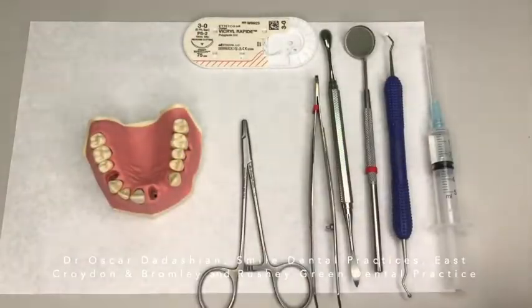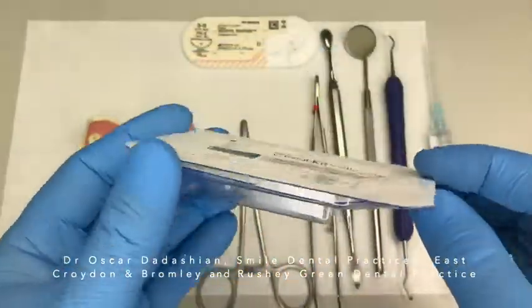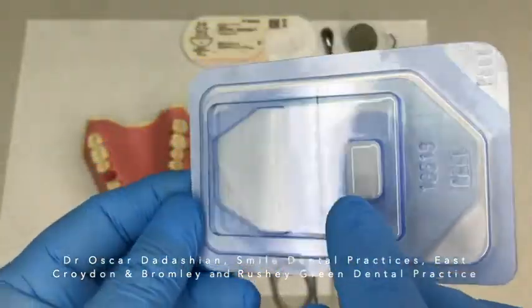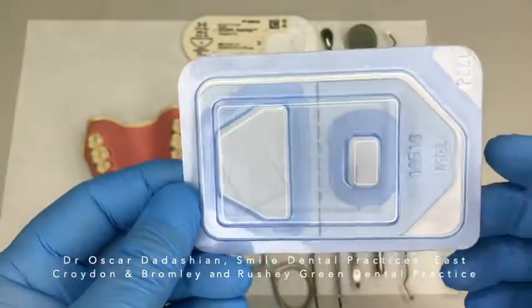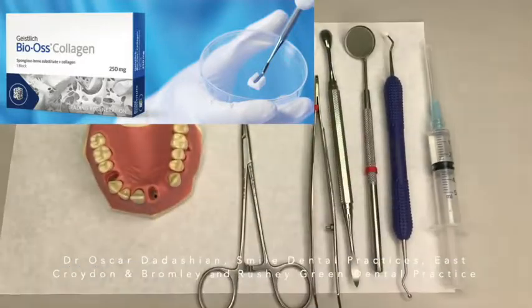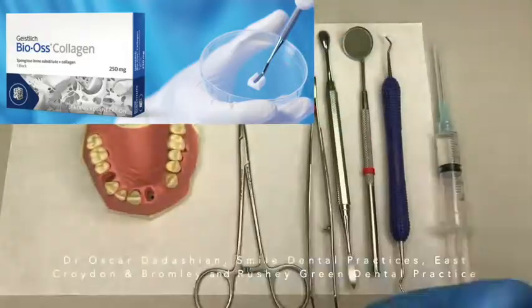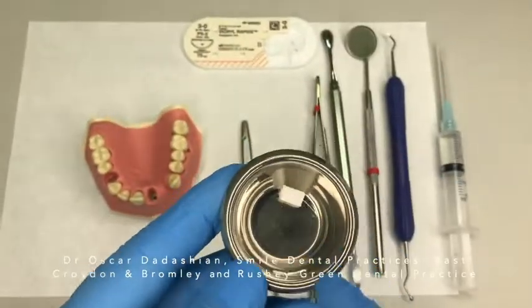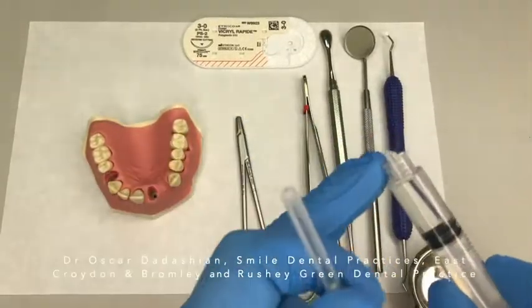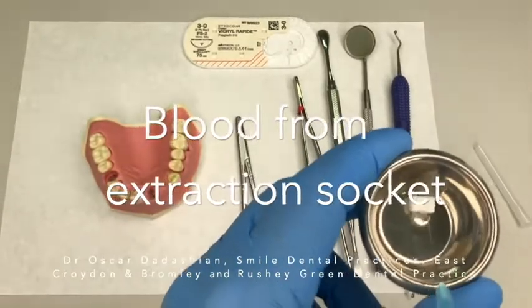When you open the pack, you have an outer pack and an inner pack. The inner pack is sterile inside the outer pack. You have the BioGuide to the left and the Bio-Oss Collagen to the right, and the Bio-Oss Collagen is like a block rather than granules. If you have a sterile dish, put it inside the sterile dish; if not, keep it in the little container it comes in and use that as your sterile dish. You now need to hydrate your Bio-Oss Collagen — either use saline solution, or if you don't have any, use a couple of drops of blood from the extraction socket.